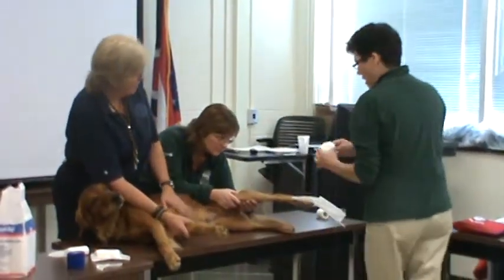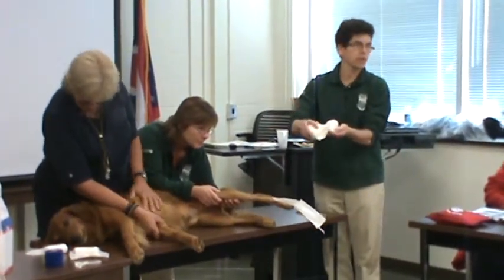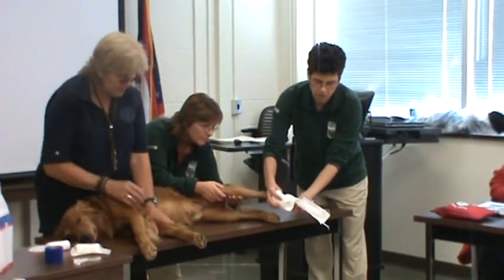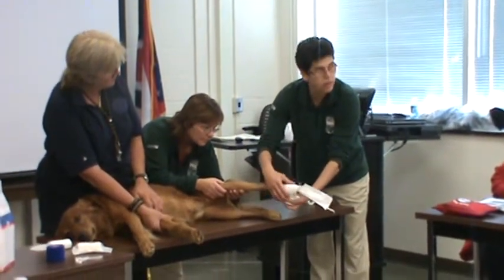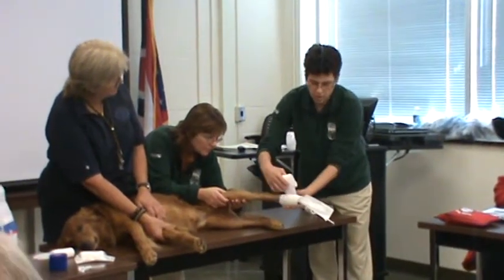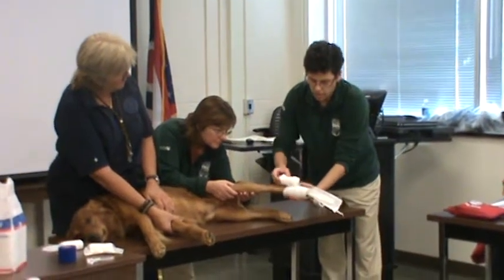Now I'm going to take my roll — see how it's set up so that the roll is rolling in this direction. I'm going to lay the flat part on the foot at the toes, then I'm going to roll it and overlap. I want to aim for about a 50% overlap and I don't want any wrinkles, because that's going to be a pressure point. So I'm going to gently go up here and continue to advance.